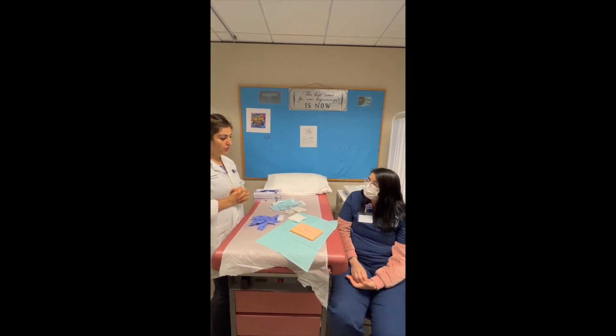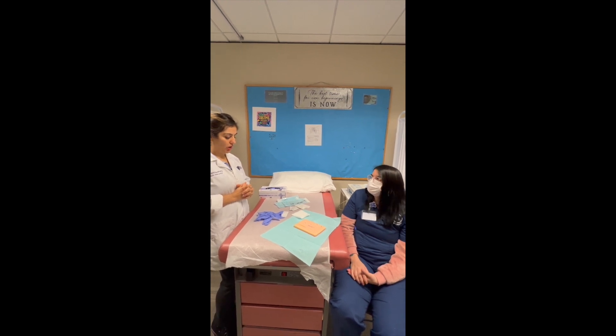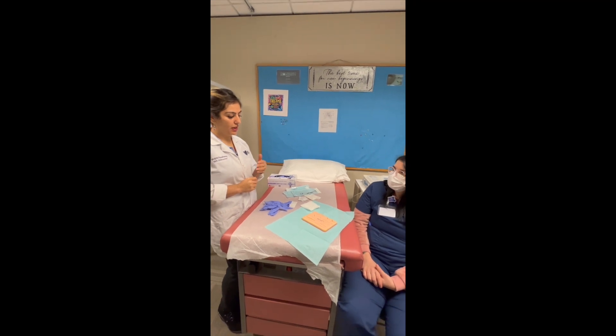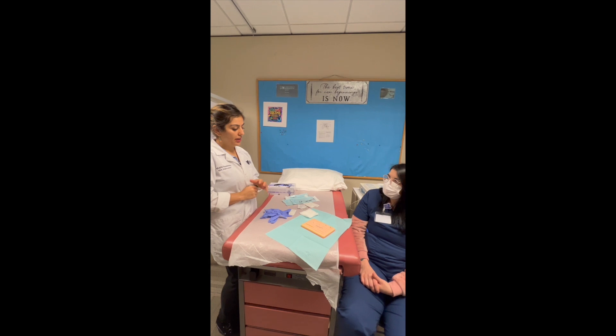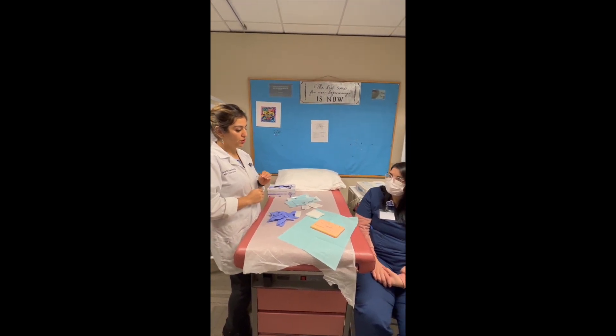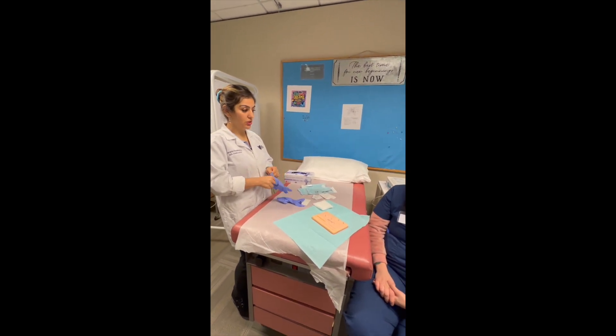Have you ever had staples or sutures removed before? What I'm going to do is clean it a little bit, then start from the middle and work my way between one and another. It's not going to hurt a lot, but it might hurt a little bit. My goal is to be as gentle as I can. If it does hurt in between, you stop me.